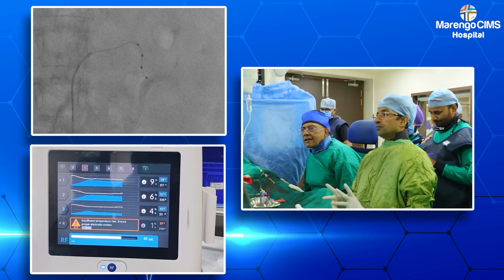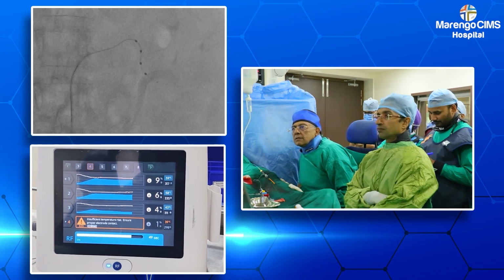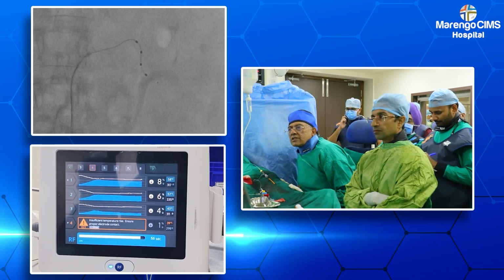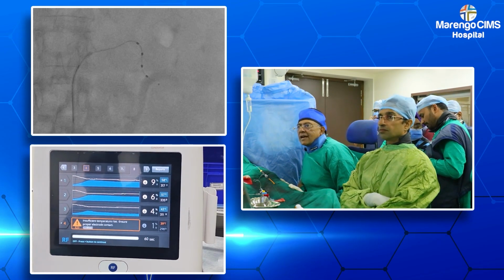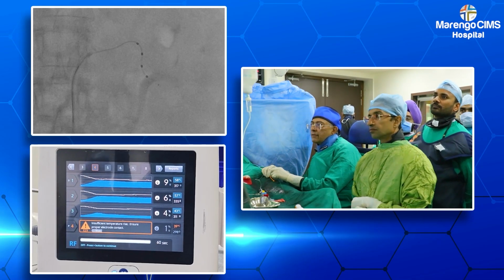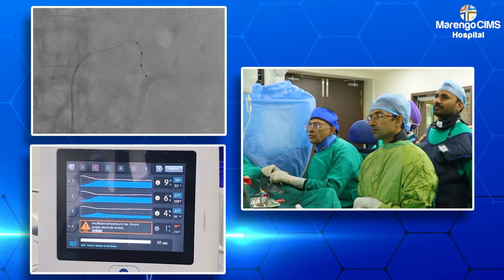The remaining 3 electrodes are doing very well. The innermost electrode is showing the higher temperature one, and the proximal one, the third one, is showing less temperature rise because there is a blood flow going there. So we are done there. The 4th electrode and the proximal most electrode did not function.